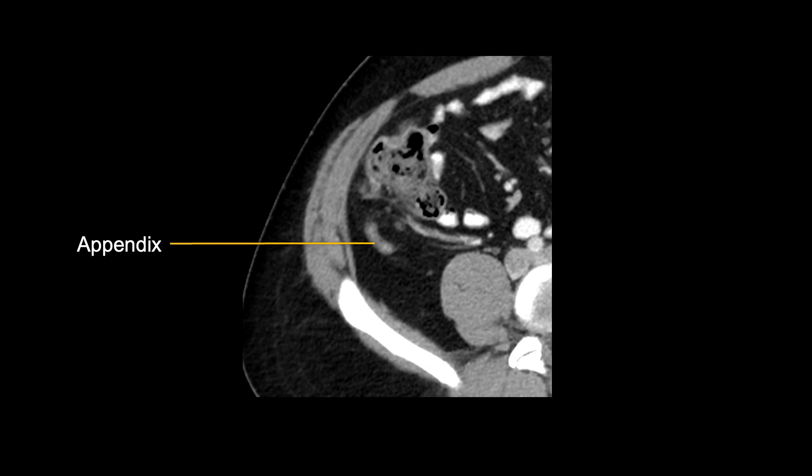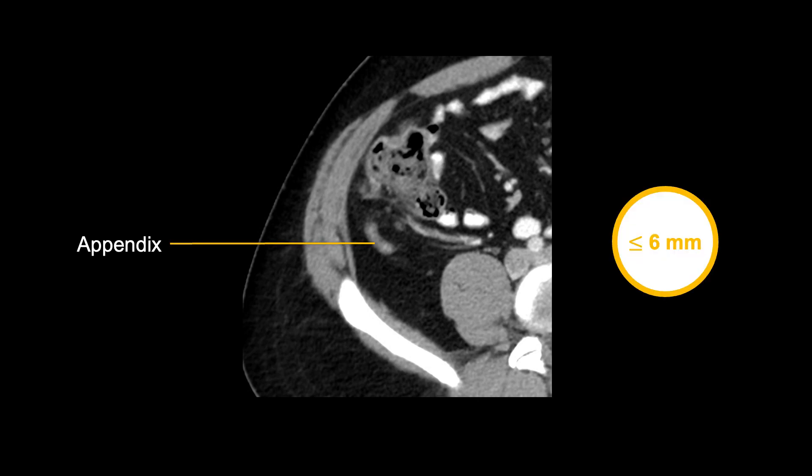The normal appendix is usually 6 mm or less in diameter, with a clean or dark appearance of the surrounding fat. Notice how the fat surrounding the appendix looks similar to the body wall or other areas in the abdomen.